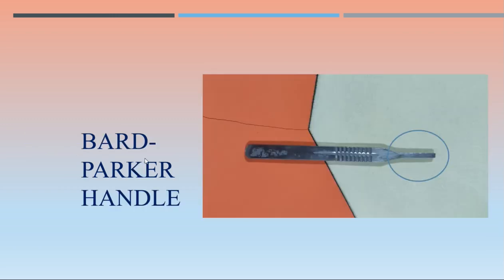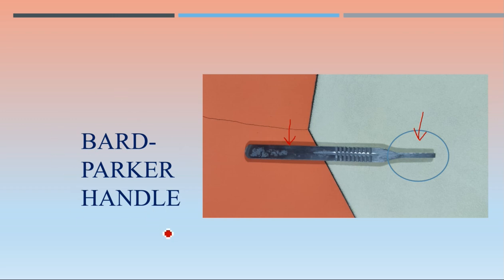This is the Bard-Parker handle — in short, BP handle. You hold the handle and the surgical blade is mounted over this area, then the instrument can be used to cut tissues and make various incisions. Two numbers are available: number three and number four. Number three is for surgical blades with smaller numbers, number four for blades number 20 and above.